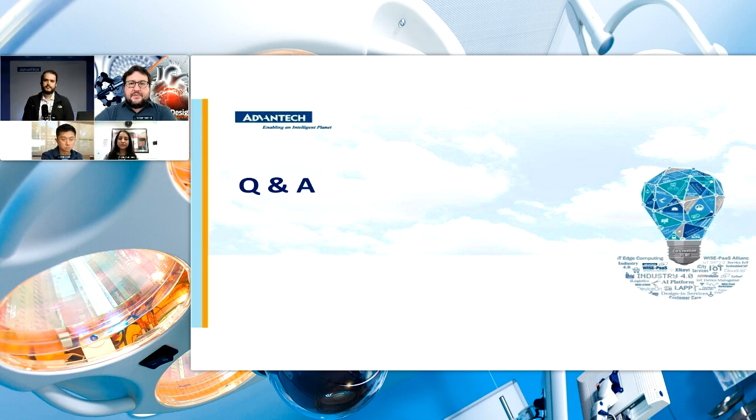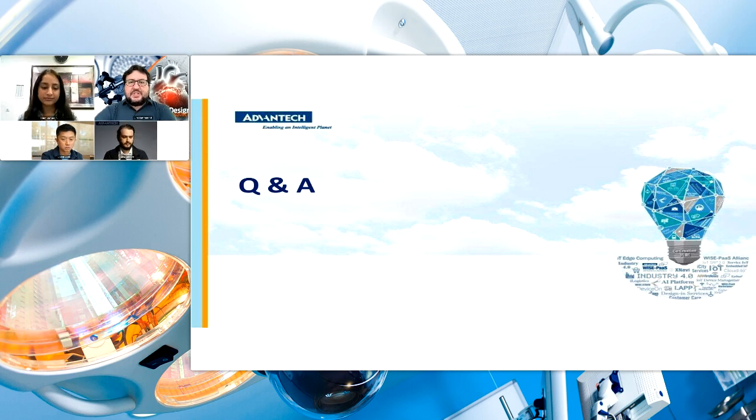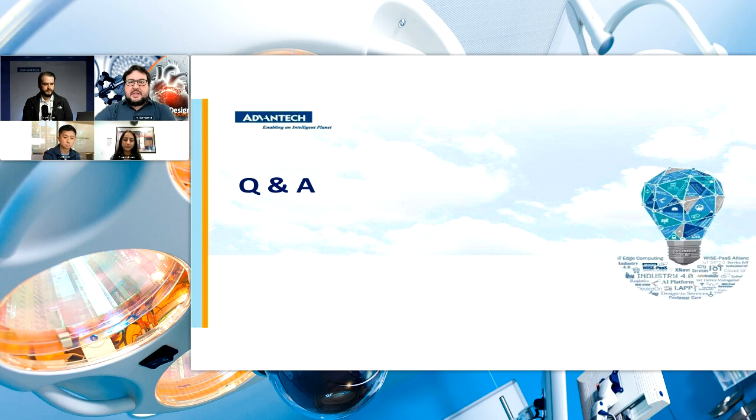Okay, great. Thank you very much. Next question, probably a good one for Sharon. What challenges might come up when you're deploying edge servers in medical imaging, and how do you address those? Sure. One of the main challenges when deploying edge servers in medical imaging is ensuring consistent and high performance data processing in diverse, sometimes resource constrained environments, like I mentioned earlier, in those rural environments. To address this, edge systems need to be equipped with powerful GPUs or specialized AI accelerators to handle these complex AI tasks.